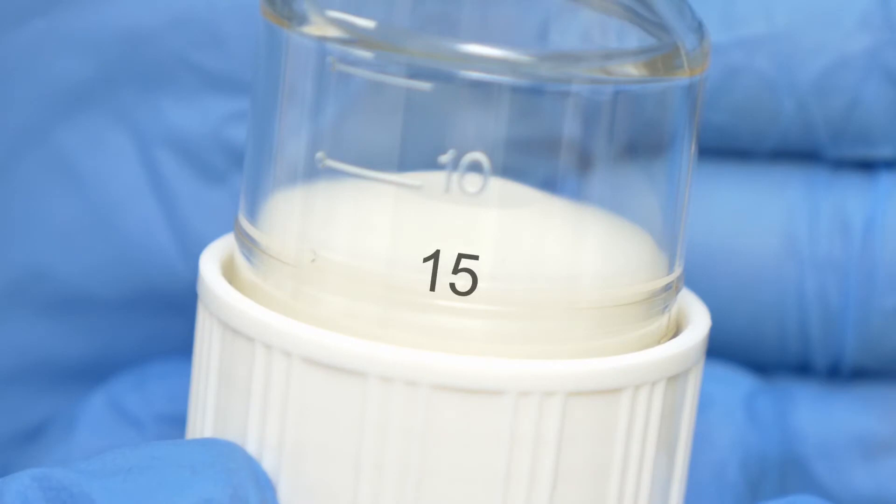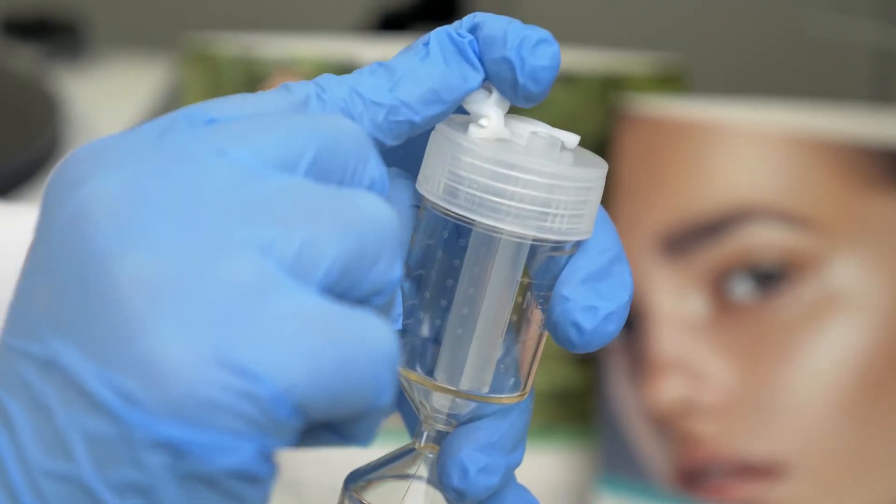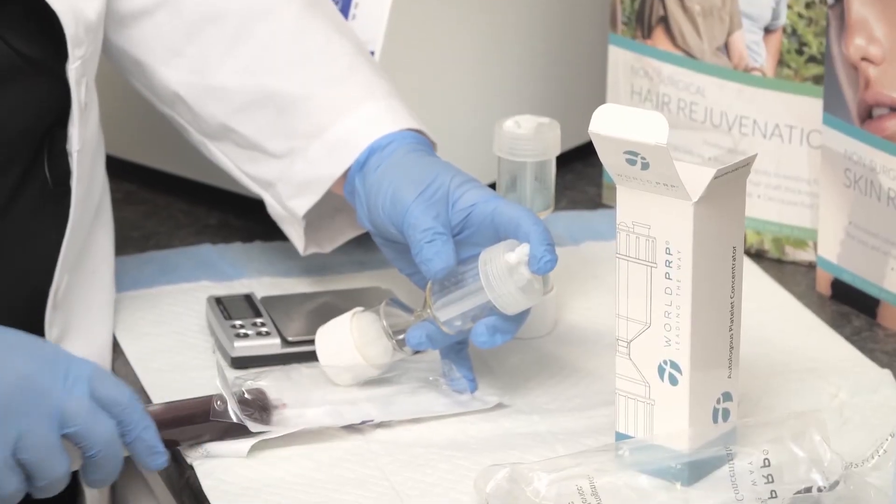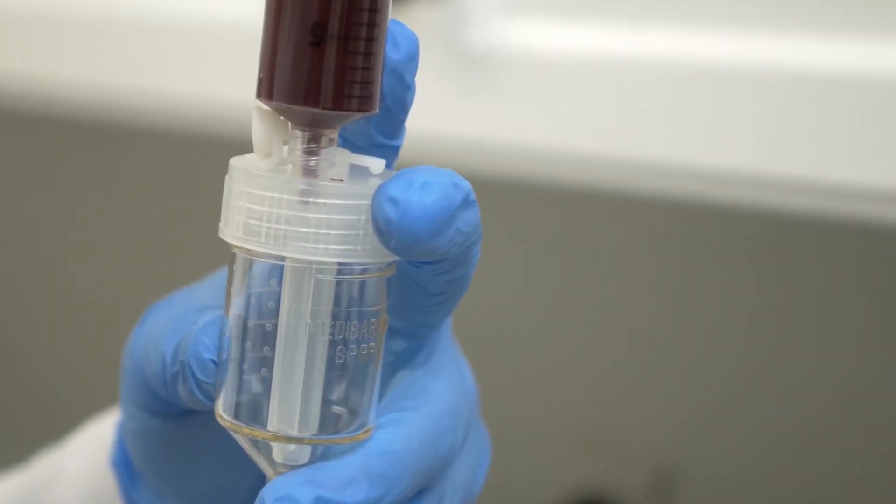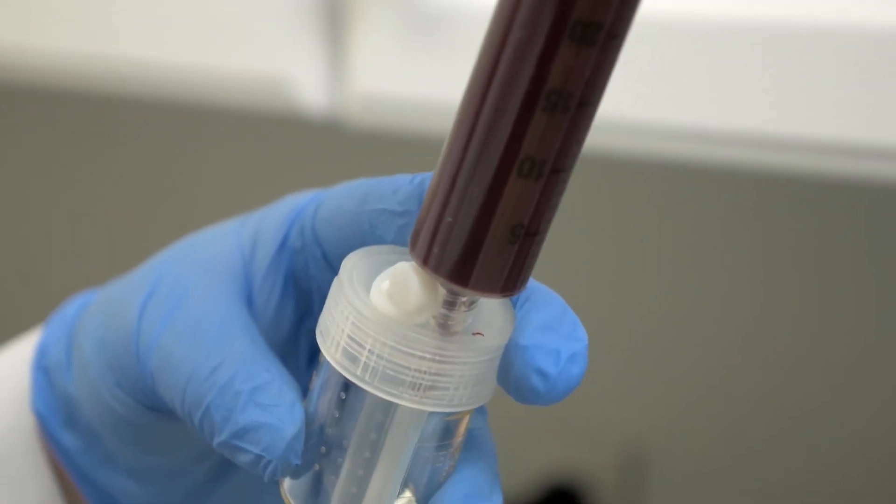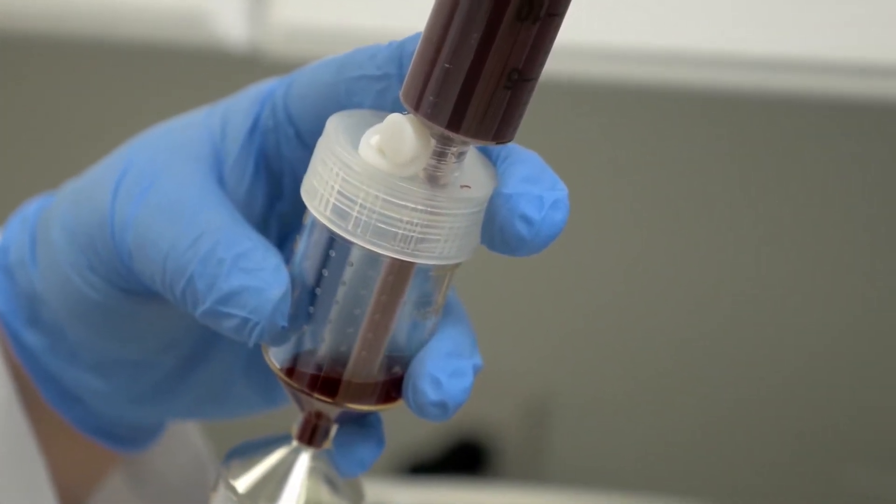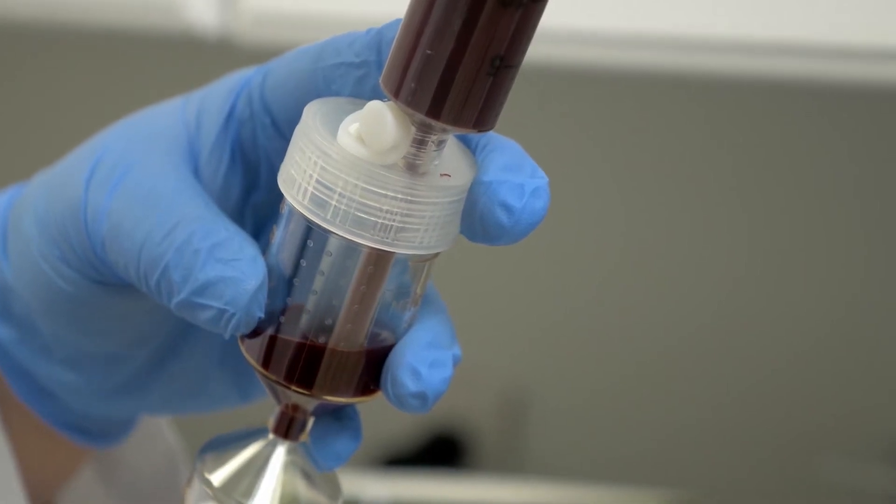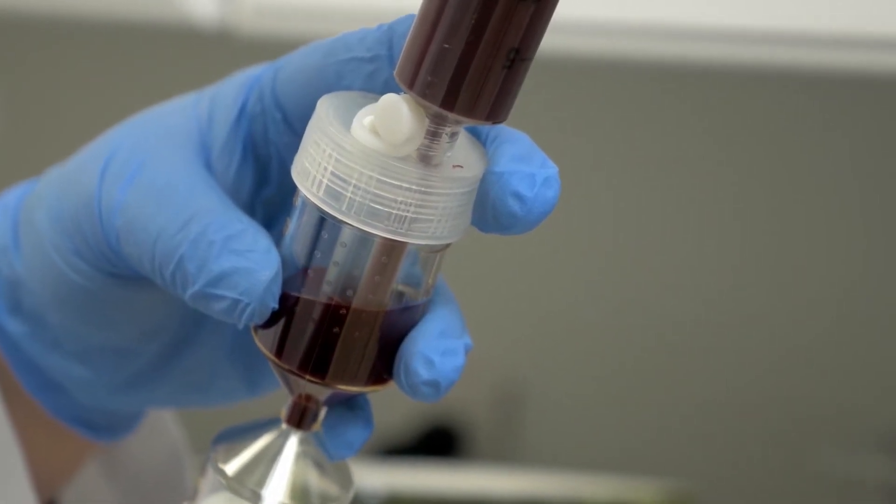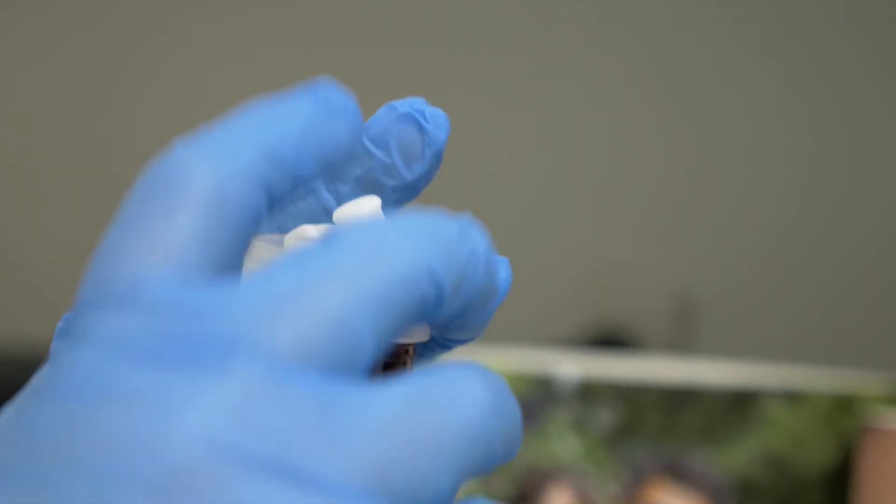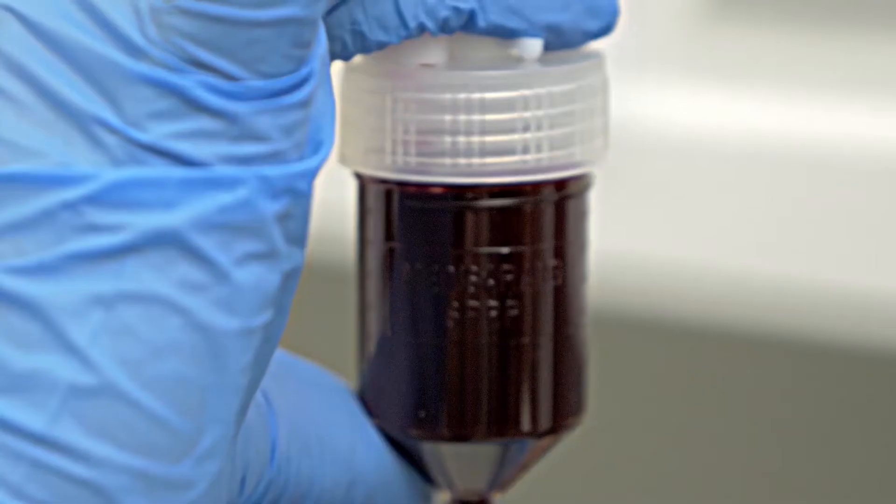Open outer port cap and transfer the whole blood into the World PRP tube using the 30 ml syringe without a needle. Do not push the plunger with force. Lean the tube at a less than 45 degree angle and gently transfer the whole blood.